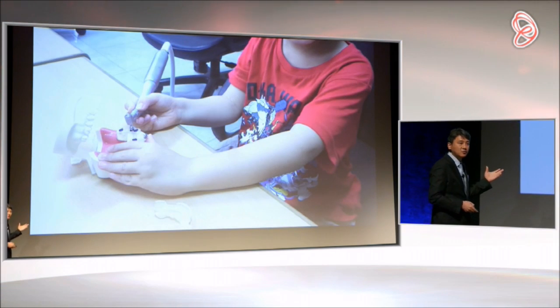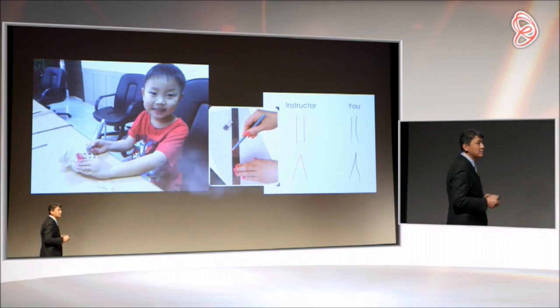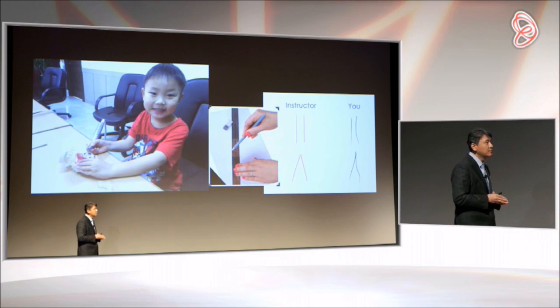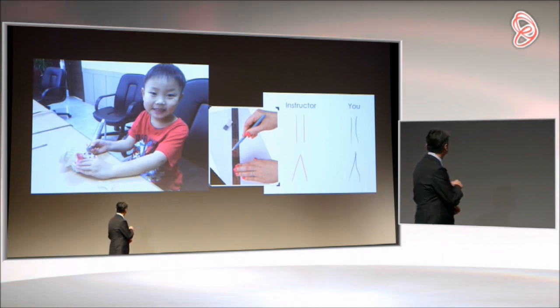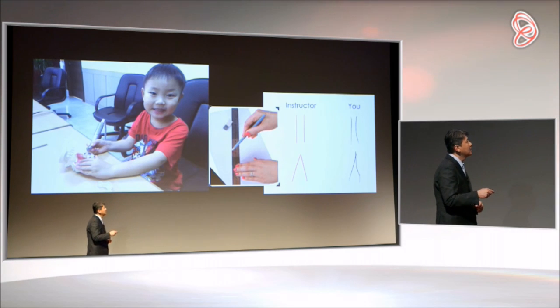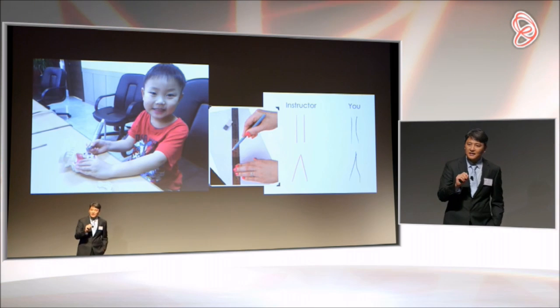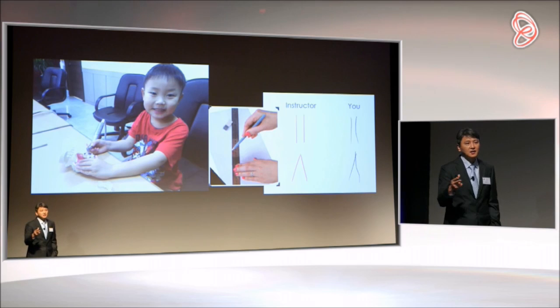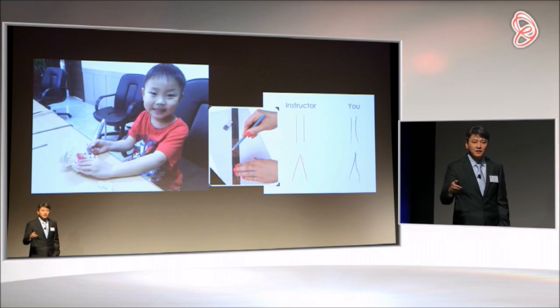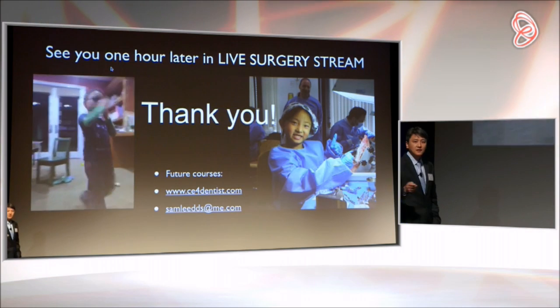Even my son, who was 5 years old at that time, is able to place implants very, very nicely because all you have to do is follow the osteotomy set by the guide. If you were to freehand, it's very difficult to draw a nice straight line. But if you have a ruler, anybody can draw 2 perfect parallel lines. Thank you very much.